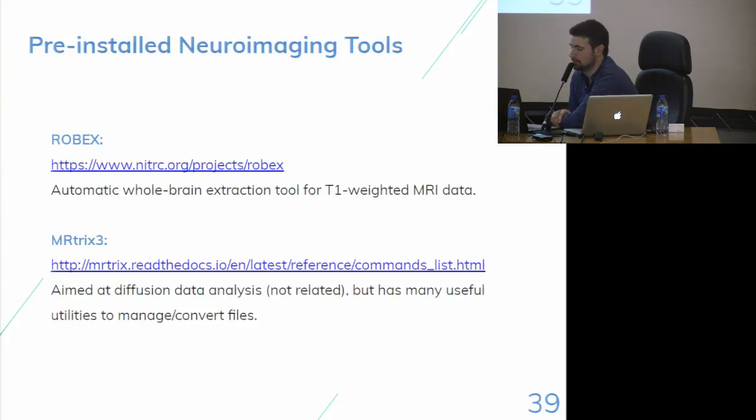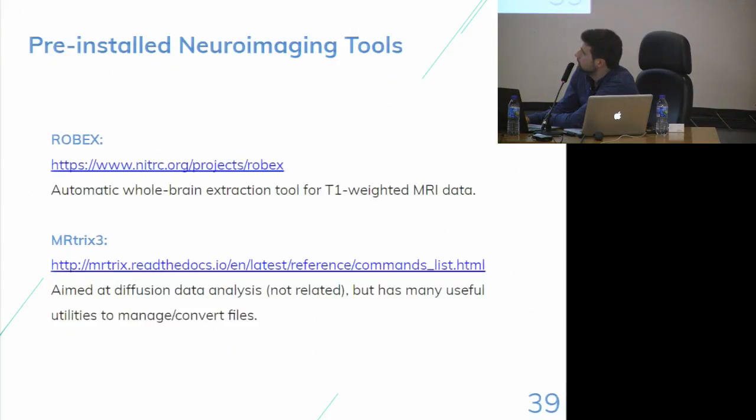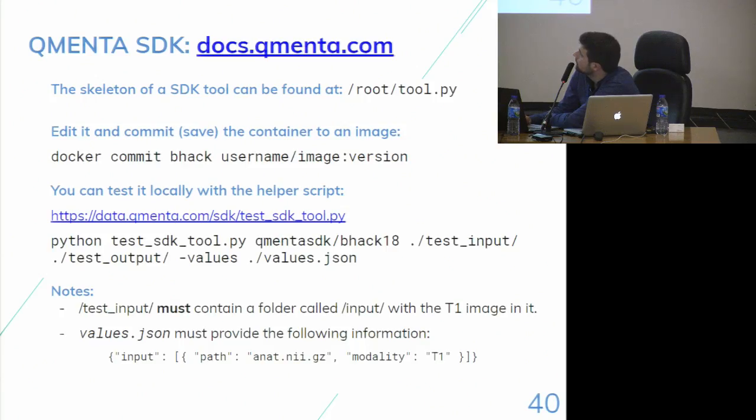And it can be really handy to convert and everything. And you can see that I put here all the reference links for the documentation for these packages, so that you can see what kind of tools you can use to extract data from the T1s.